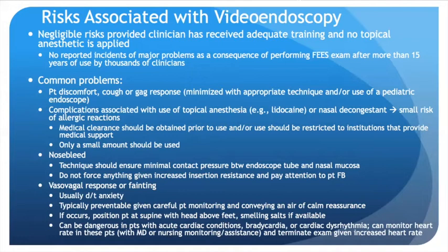Vasovagal response can be dangerous in patients with acute cardiac conditions, bradycardia, or cardiac dysrhythmia. So you can monitor the heart rate in these patients with the assistance of doctors and nurses, and you'll want to terminate the exam given increased heart rate in these patients.